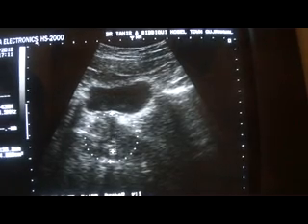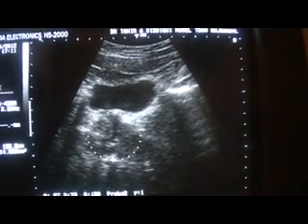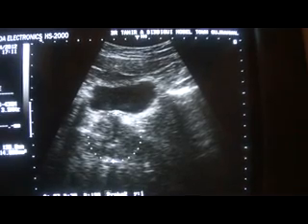Now in the longitudinal section of the prostate, which I have magnified to show you, this is the prostatic urethra and here you see a tiny concretion within the prostatic urethra. This is the concretion — a small concretion.